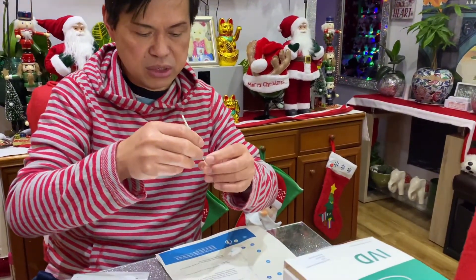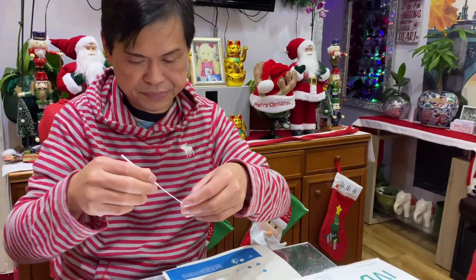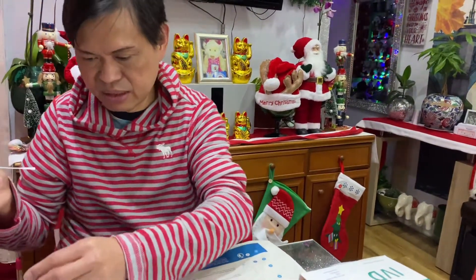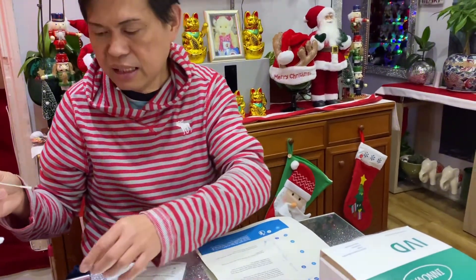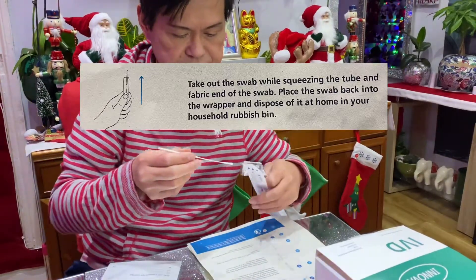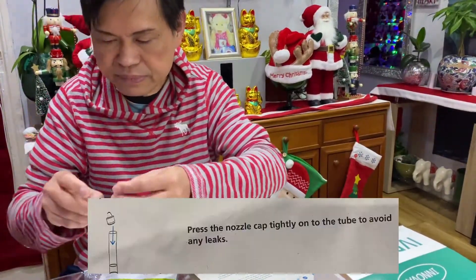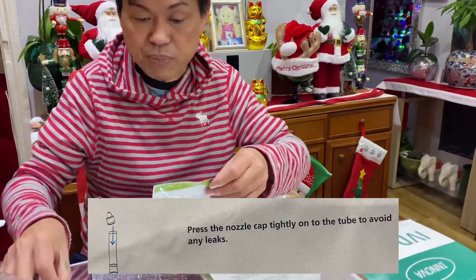Take out the swab by squeezing the tube against the fabric of the swab. Then put the nozzle on tightly and close it. Place it back and open up your test cartridge.